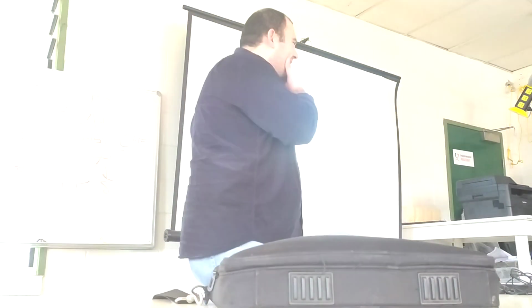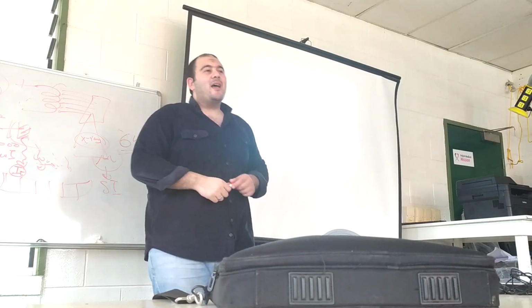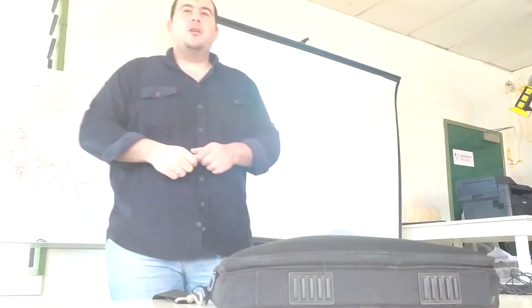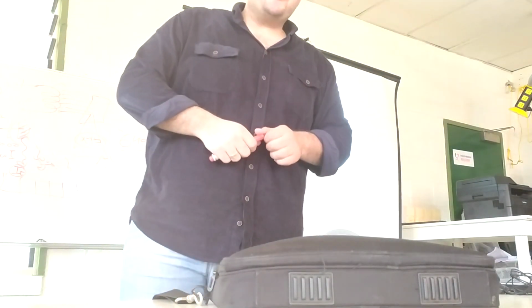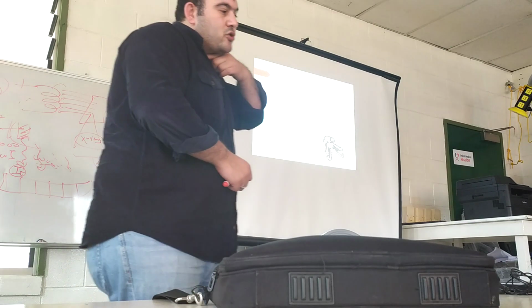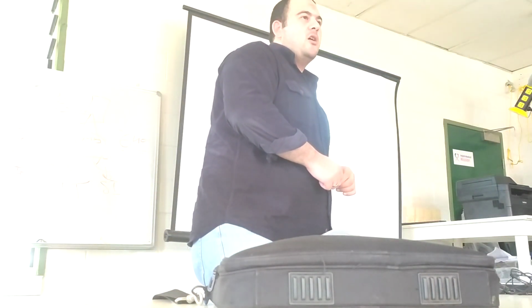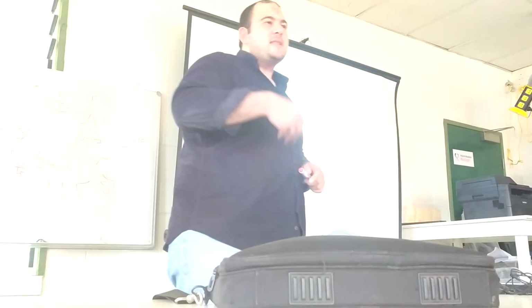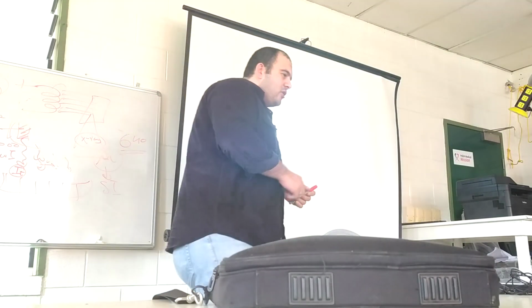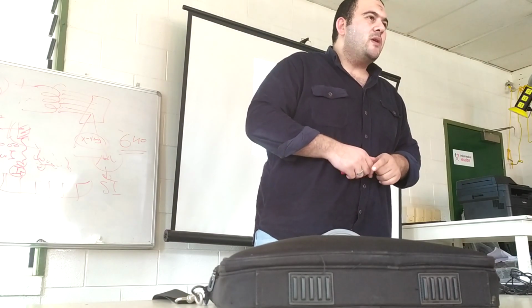The aim of CT scan is to expose the patient to less patient dose and to get an optimum diagnostic image. This is the main target of CT scan. Sometimes we overexpose the patients to X-ray with no increase in the image quality. The important thing is to know well how to get the optimum diagnostic image with less patient dose.